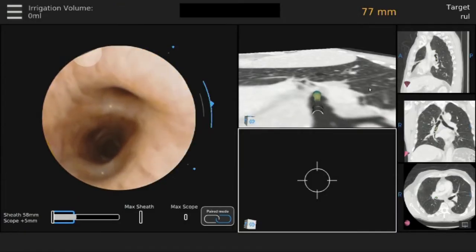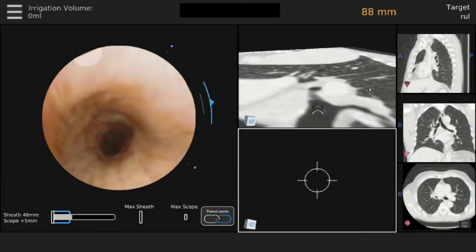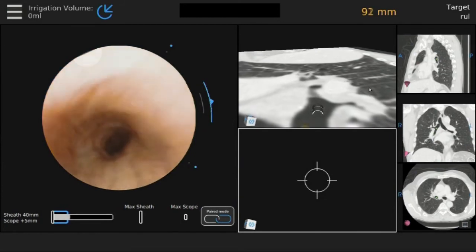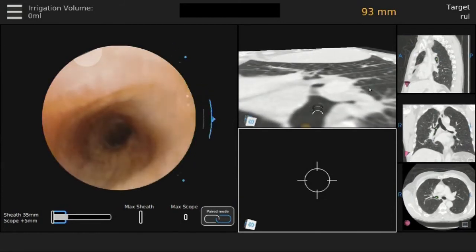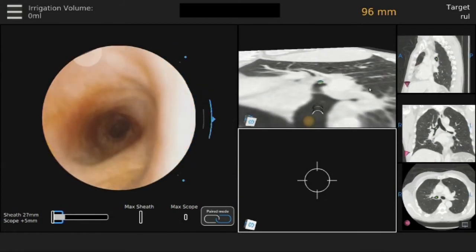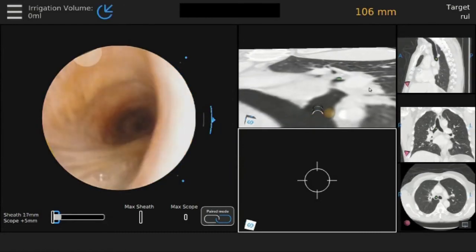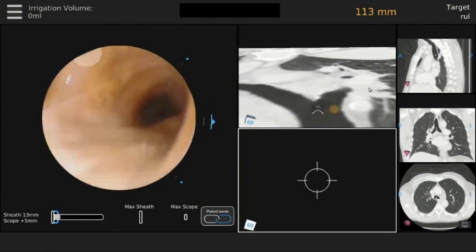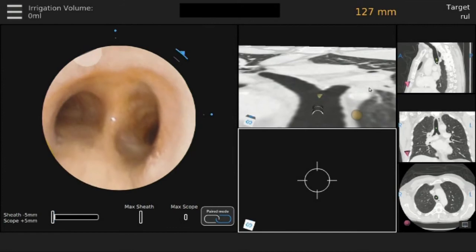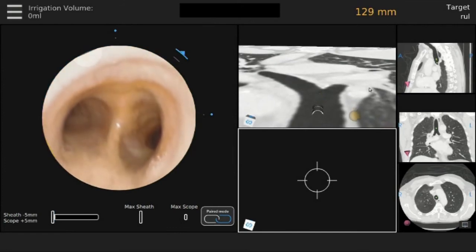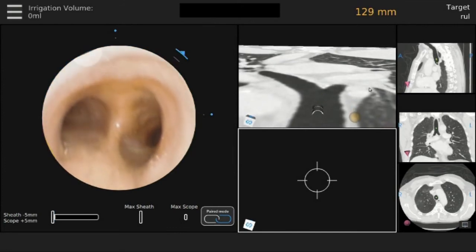The airways are inspected during withdrawal of the bronchoscope to ensure no bleeding. Initial pathologic examination was consistent with squamous cell carcinoma. Post-procedure chest X-ray demonstrated no pneumothorax, and the patient was discharged to home.